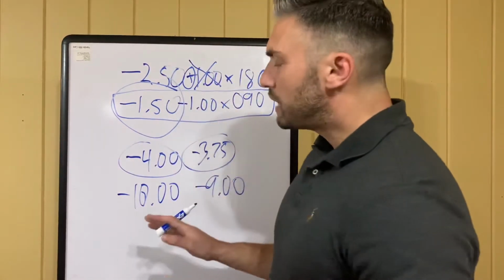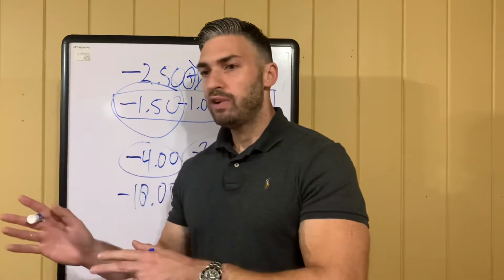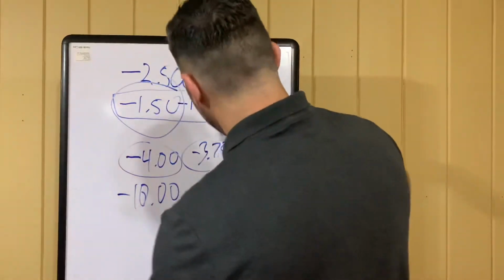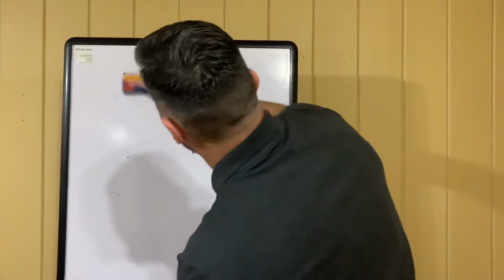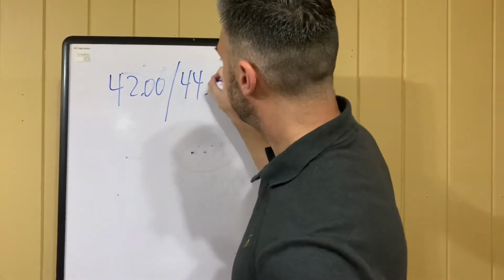And the third step when you're evaluating these types of questions is to evaluate the K readings in relationship to the refraction. And let me draw that up here for you. So if you have K readings, it'll look something like this.